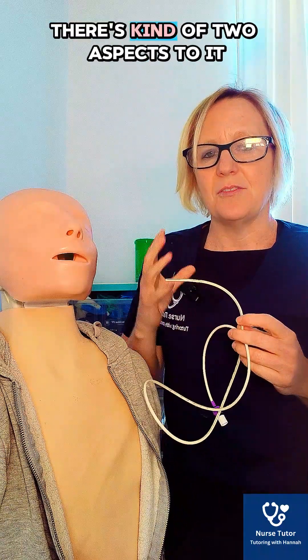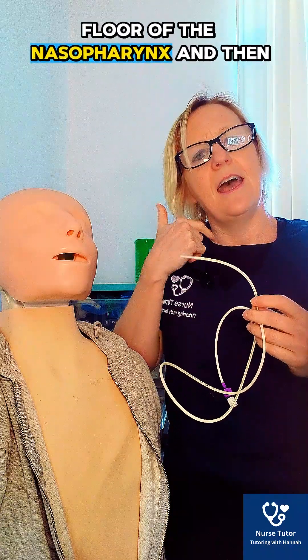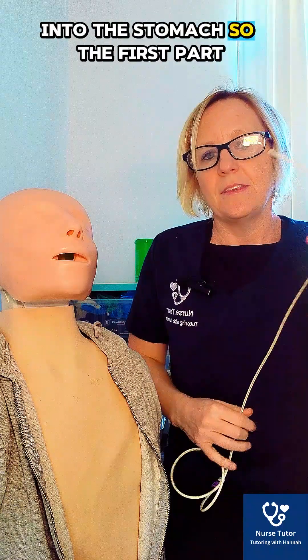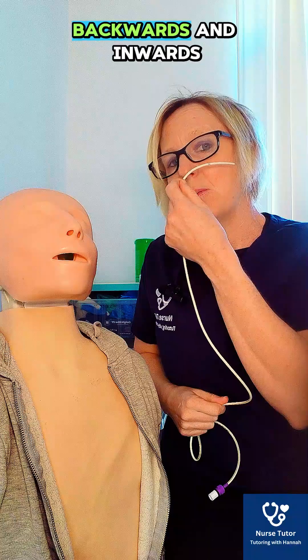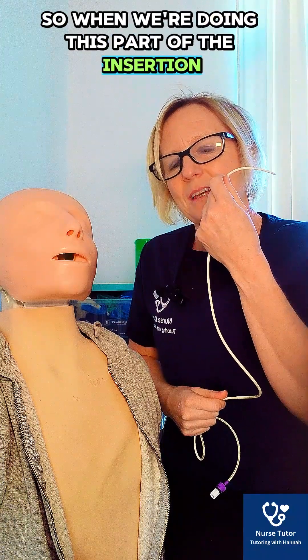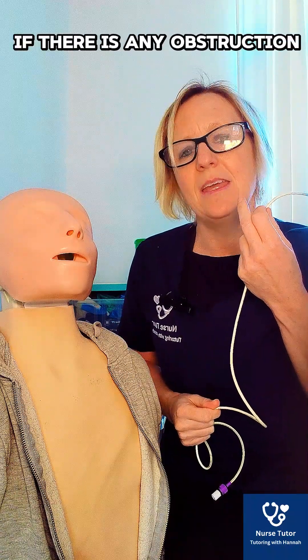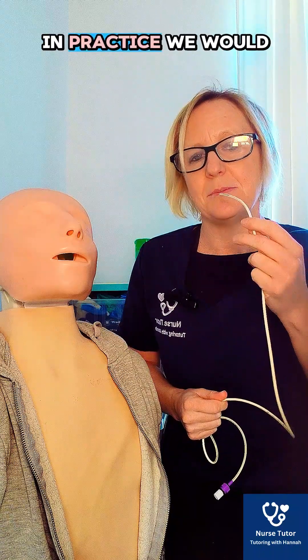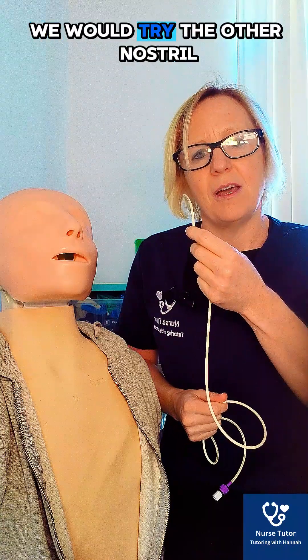When inserting the tube, there are two aspects. The first is inserting it along the floor of the nasopharynx — advancing it backwards and inwards. During this part of the insertion, we need to verbalise and be aware of any obstruction. If there is obstruction, we would slightly change the position of the tube, and if obstruction persists, we would try the other nostril.